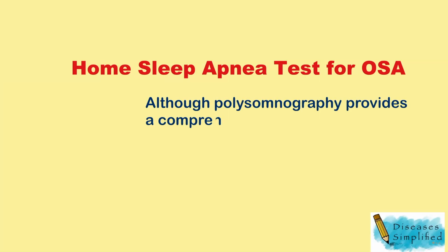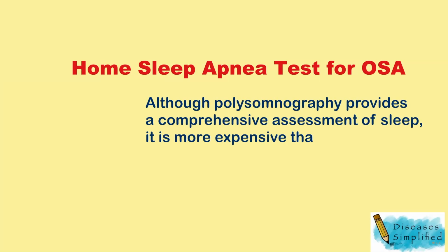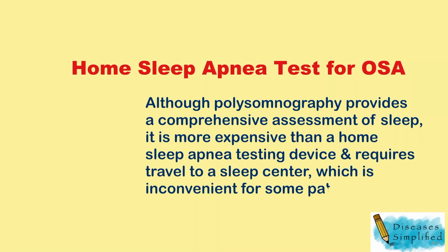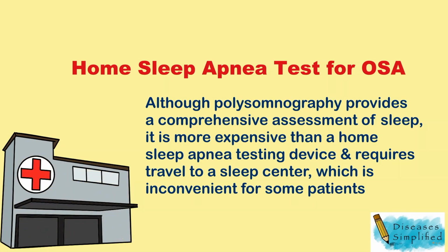Although polysomnography provides a comprehensive assessment of sleep, it is more expensive than a home sleep apnea testing device and requires travel to a sleep center, which is inconvenient for some patients.